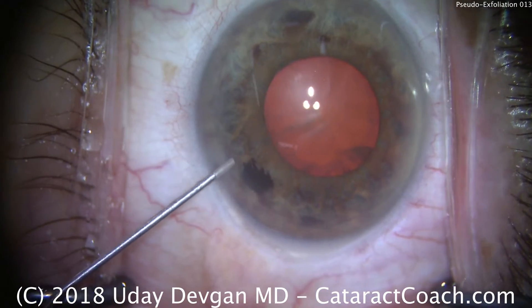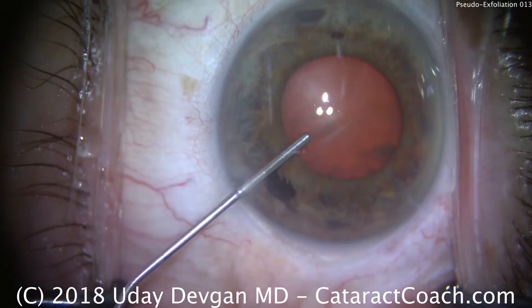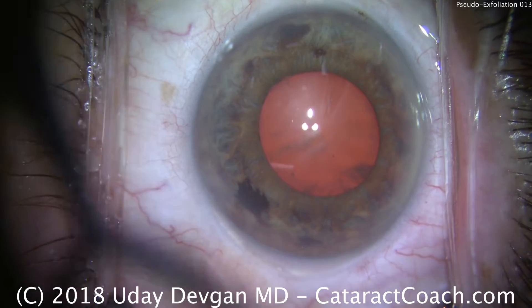We'll also do viscomydriasis, injecting a dispersive viscoelastic and trying to push the iris back. So we get about a four and a half, maybe four millimeter pupil. If you look at the edge of the pupil, you can see there's the pseudoexfoliation material.